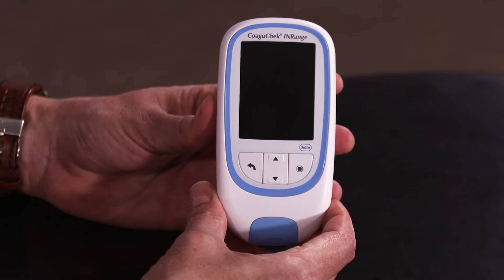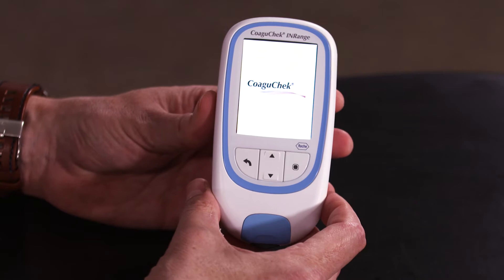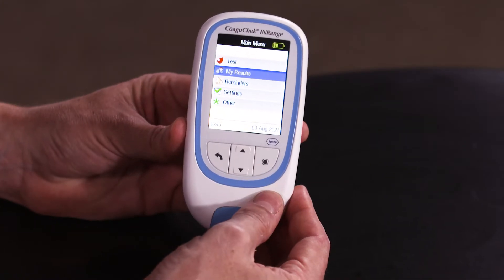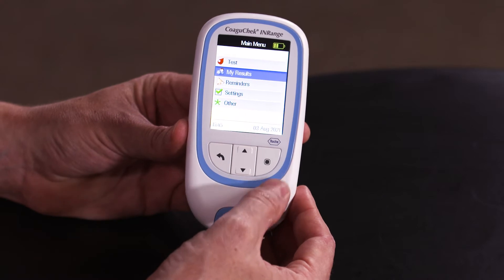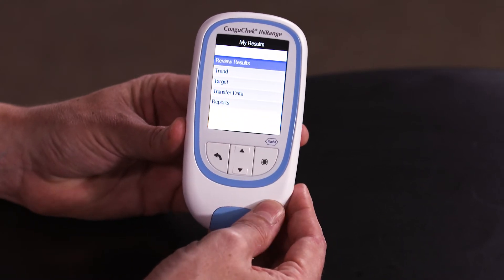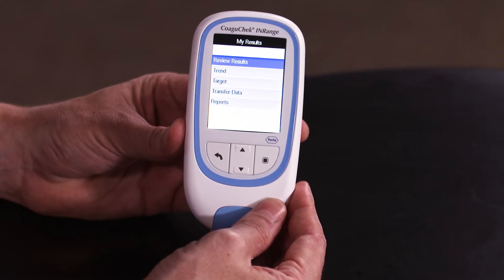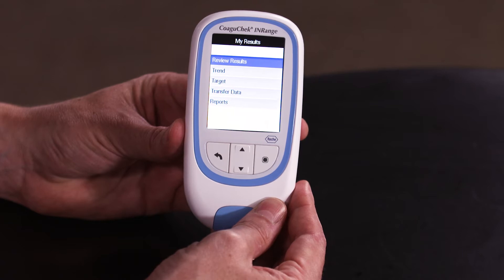To turn the meter on press the power key. To navigate through the menu you can press the up and down arrow keys. To select my result press the power key to confirm. In review results you can see the history of your results, and for all other options please refer to the manual for further information.